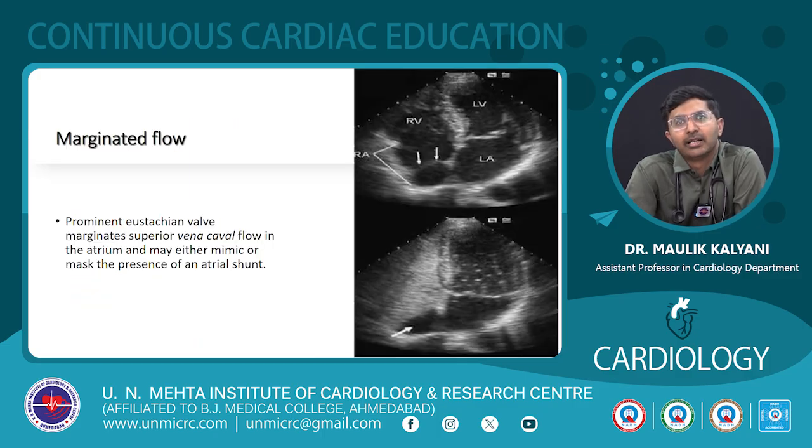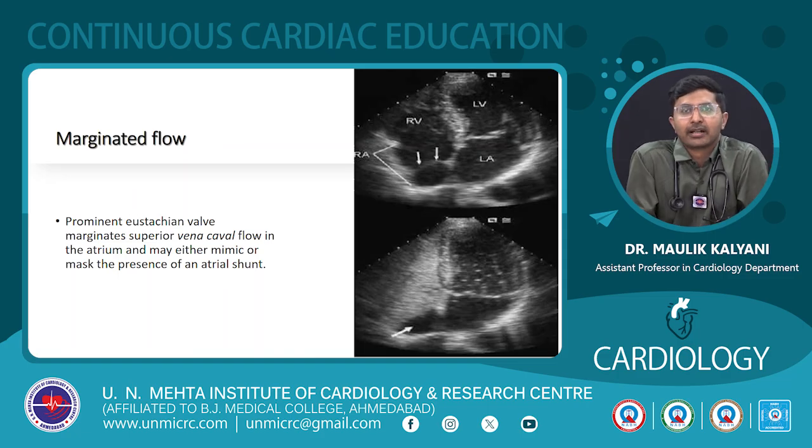Then there is a marginated flow. Marginated flow is suggestive of the streaming of the flow in the cardiac chambers.